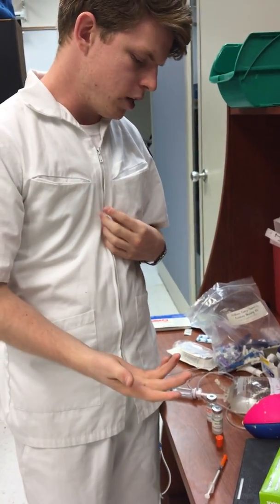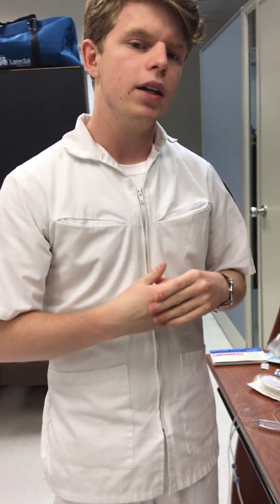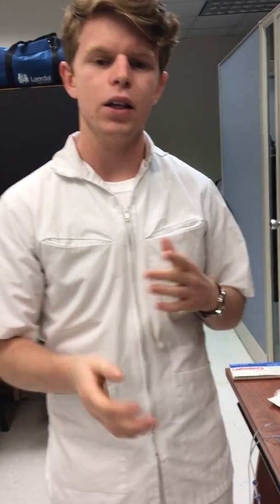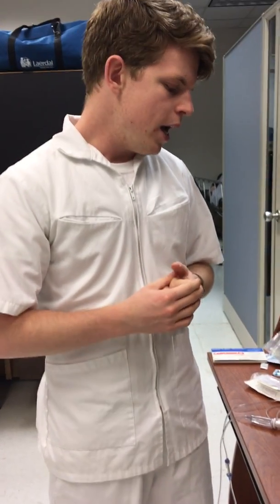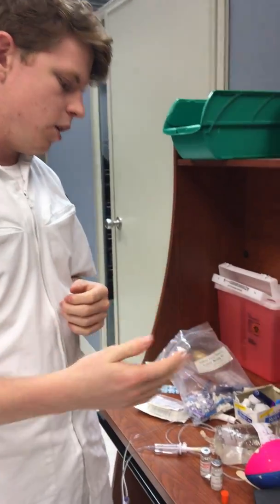Then I would go over to the patient. I would do an assessment. I would make sure that I don't go into the same administration site as what was previously given. There are 3 administration sites that you can use. You can use the abdomen, the back of the arm, and also the thigh. But usually we use the abdomen because it has the most subcutaneous tissue and it's easiest to get to. And so you want to rotate the sites as you go with each dose of insulin.